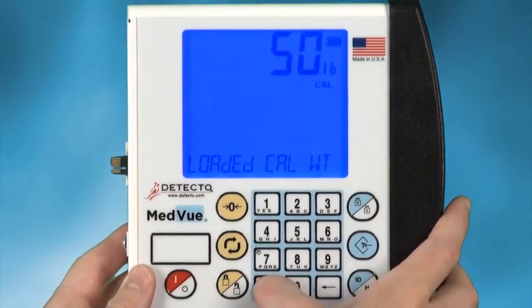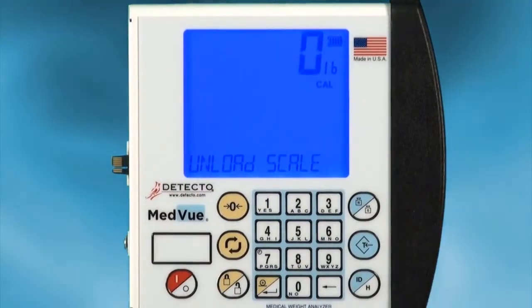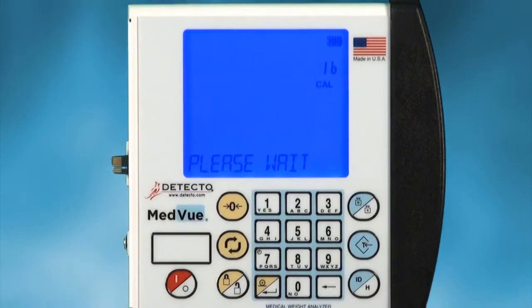After the MedVue calibrates this weight, it will then prompt to calibrate zero weight on the scale. Once calibration is complete, test the scale to see if it was calibrated correctly by weighing a known weight.